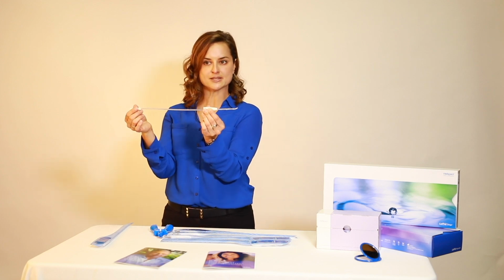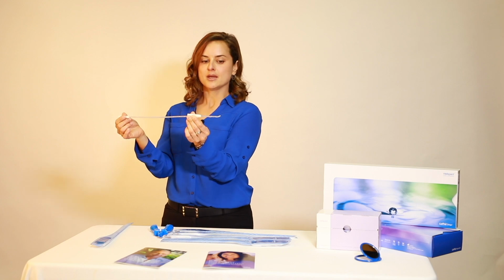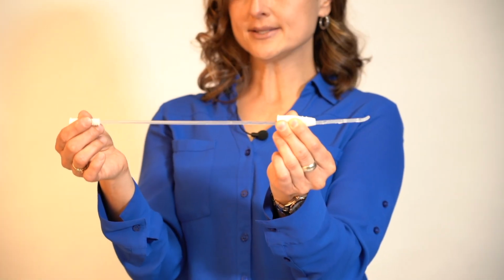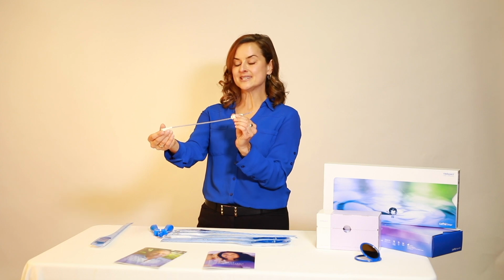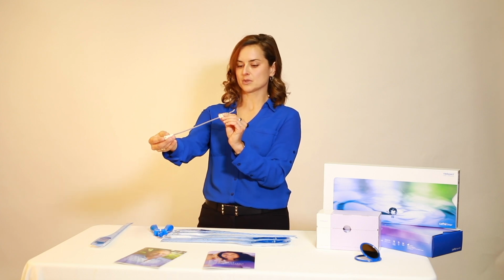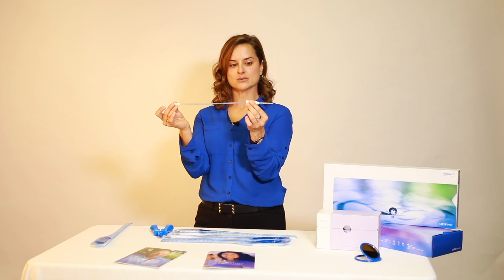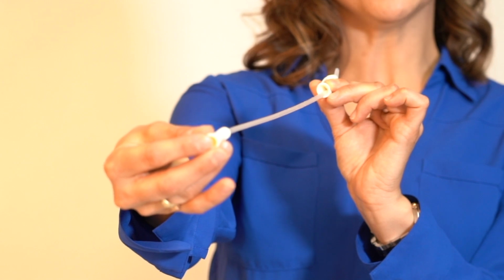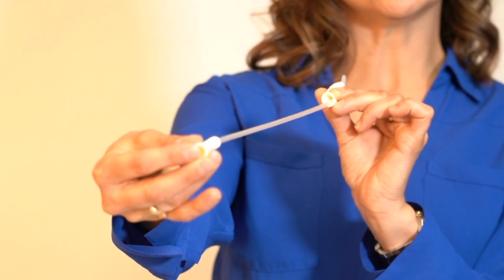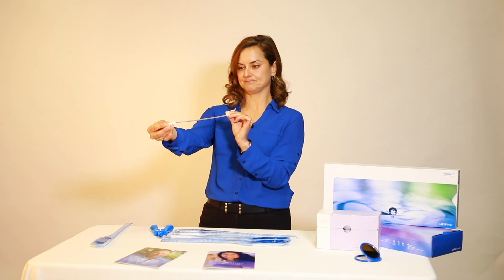I'd like to point out that the LoFric Origo that I'm holding has a coude tip or a curved tip catheter. It's important that the coude tip stays in an upward pointing position throughout the catheterization procedure. The LoFric Origo has an indicator ridge on the funnel of the catheter. So using your two hands, with your left hand on the insertion grip, your right hand on the funnel, if you look down the catheter, notice the position of the raised line on the funnel when the coude tip is pointing up. You want to keep the catheter in that same position throughout the catheterization procedure.